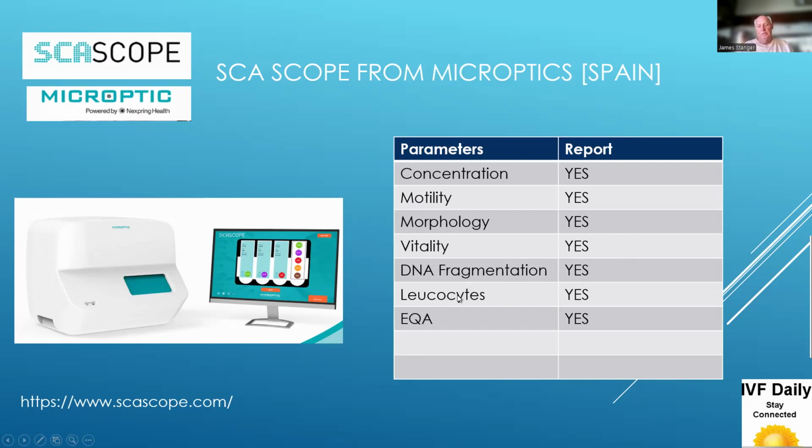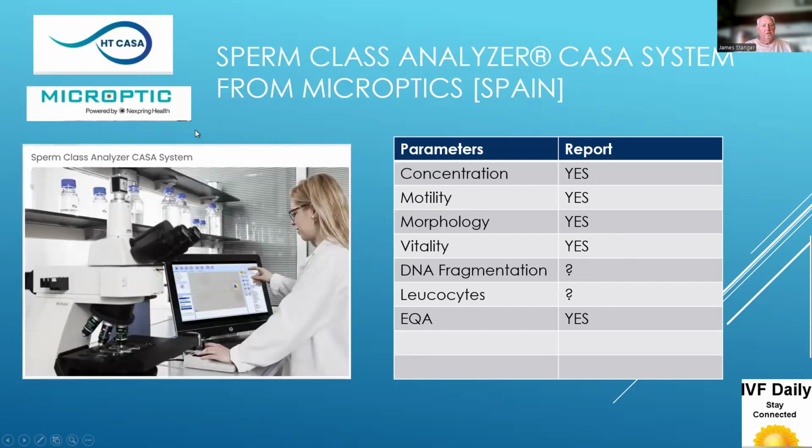So really you need to put 4 or 5 slides for a semen sample, and as I understand it, they're processed in the machine one at a time. These can be linked to the database system and provide some uniformity in assessments. They do provide the original CASA system, which was a small video camera on a microscope, that I think had this functionality, just doing the concentration, motility, and apparently morphology and vitality, but I'm not entirely sure about this.